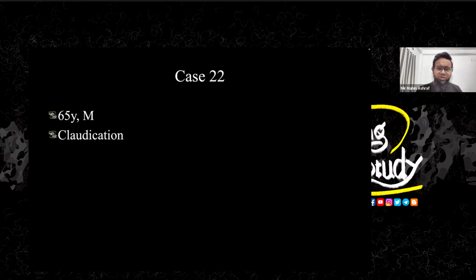So this is a 65-year-old male patient who came with claudication. He can't actually walk. After one or two steps, he feels very much pain. So let's see what we have got on ultrasound.